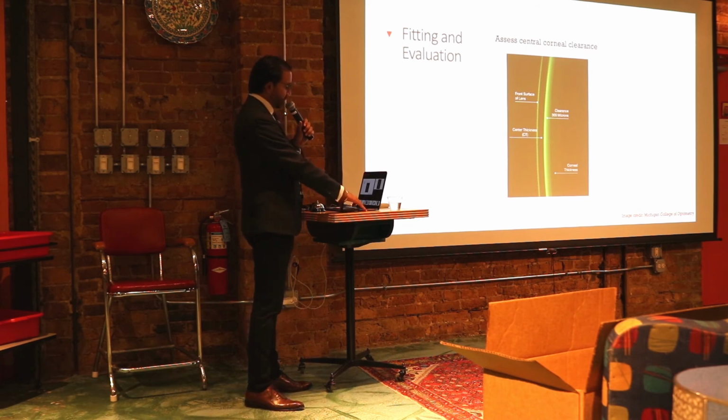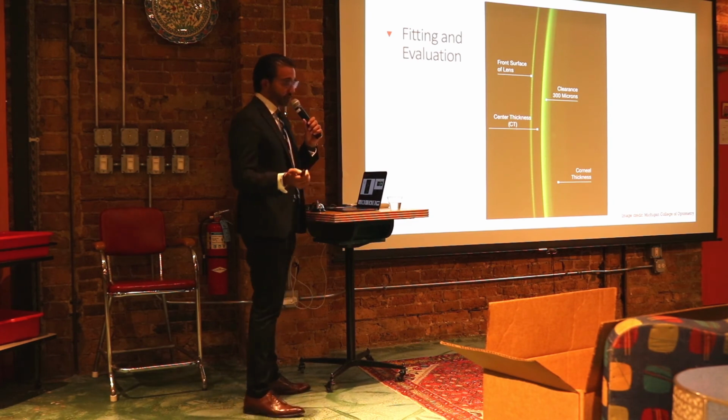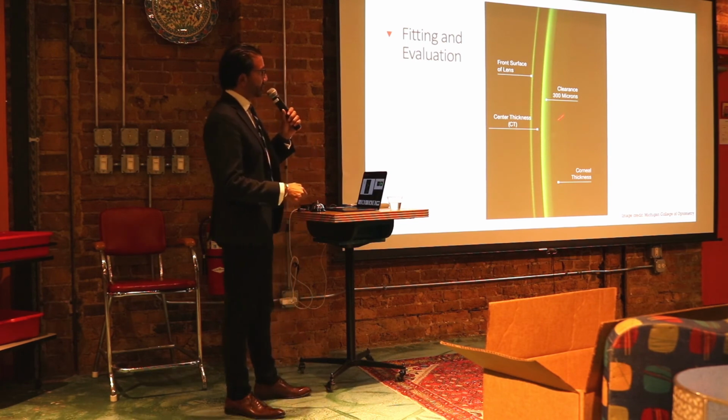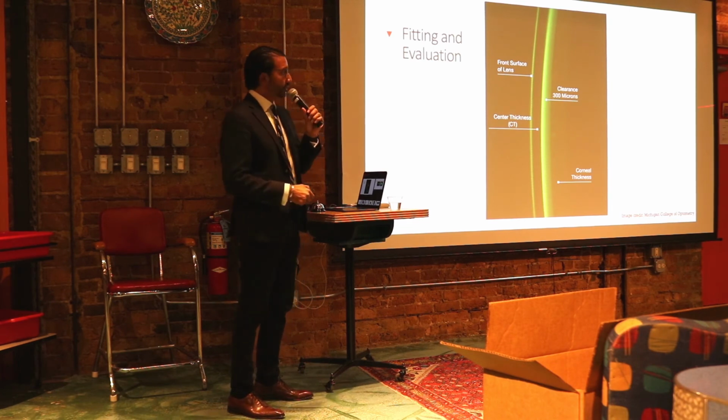This is a great image provided by the Michigan College of Optometry. This is behind the slit lamp. And if you do not have an OCT, it's okay. Scleral lenses can be fit without an OCT. Again, to determine how much corneal clearance you have, you can use a reference point as the actual trial lens. If you know your trial lens is 300 microns, then just use the ratio, how much fluorescein you see compared to the thickness of the lens, and that will give you an estimate of how much corneal clearance you have.